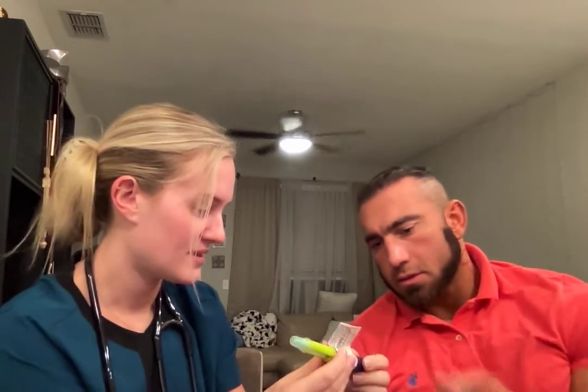And then the way this works is there's a little dial, so you'll dial back how many units you need. So your ratio is 20 units per day. Okay. So you would just essentially dial it back to 20. Clockwise? Yep. Okay. And then if you do go too far, so say you accidentally go to like 28, you can just pull it back. Oh, okay. And go to 20. And the same thing, if you're too short, like at 18, you just click to 20. I didn't know if it would ruin the pen or not. No, yeah. You can adjust it.